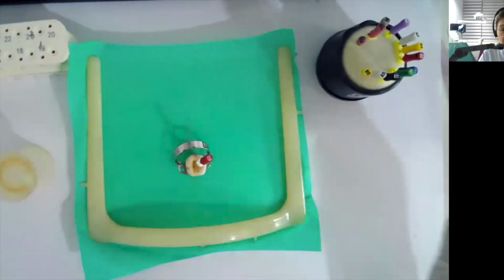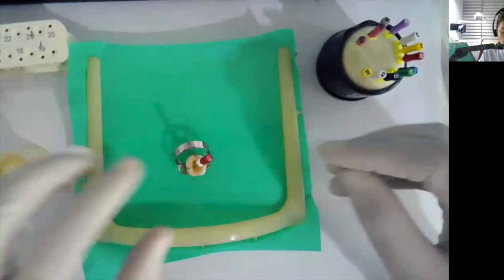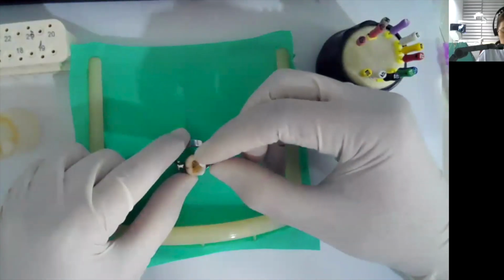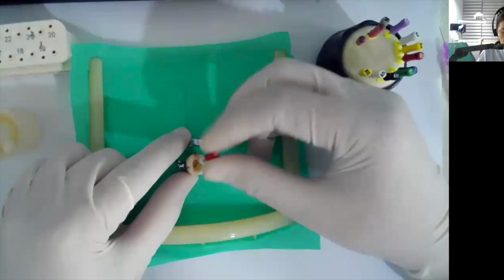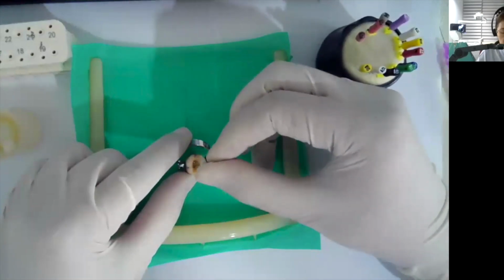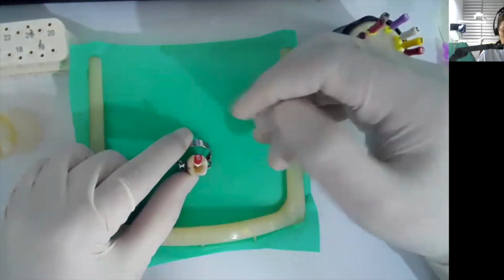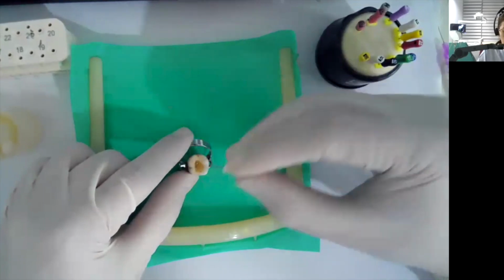So what about the length? As I've said, it's only about crown length plus even 1 millimeter, just at the orifice to enlarge the orifice. And to enlarge the orifice, I'll do the reaming action using the RT file and then pull it up. This is on the mesiobuccal. And then I'll go now to the mesiolingual. And now I'll do the same on the distal.